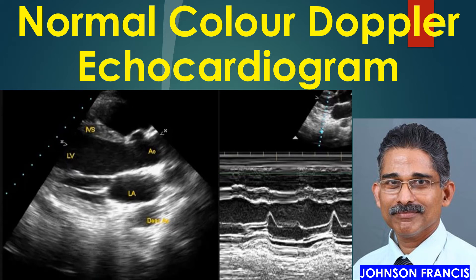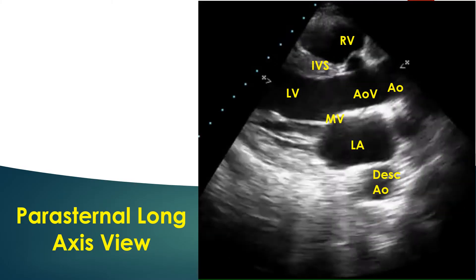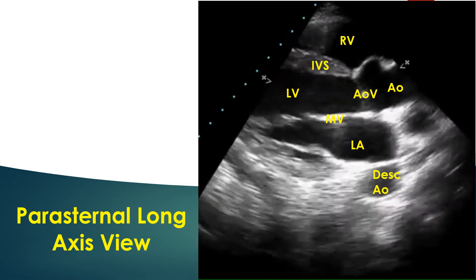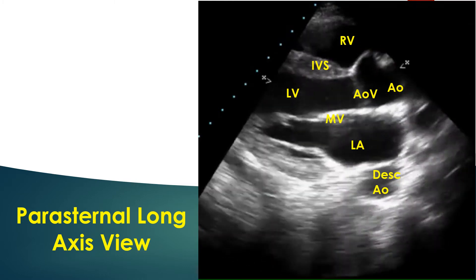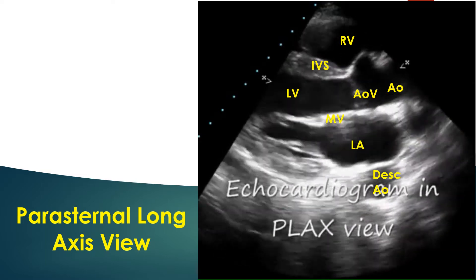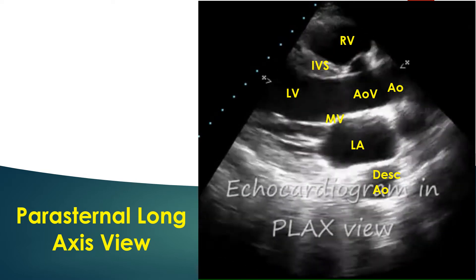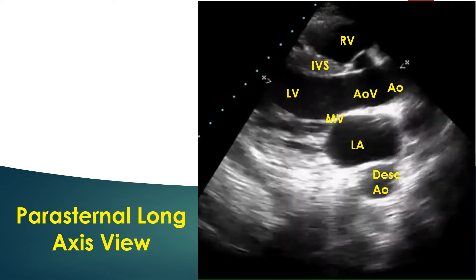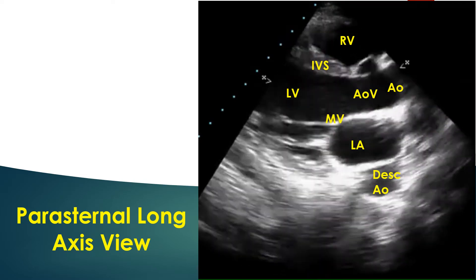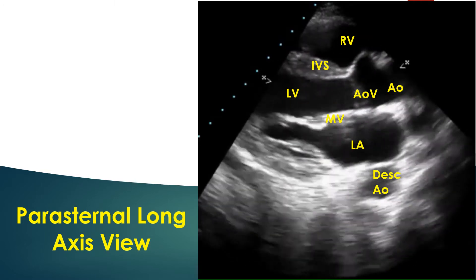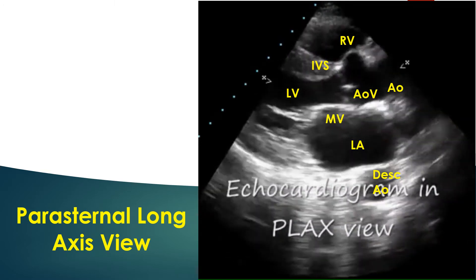Normal color Doppler echocardiogram. Parasternal long axis view is usually the first view obtained during echocardiography. It is obtained by keeping the transducer in the left parasternal region with the subject in the left lateral position. The beam cuts the heart in its base to apex axis.